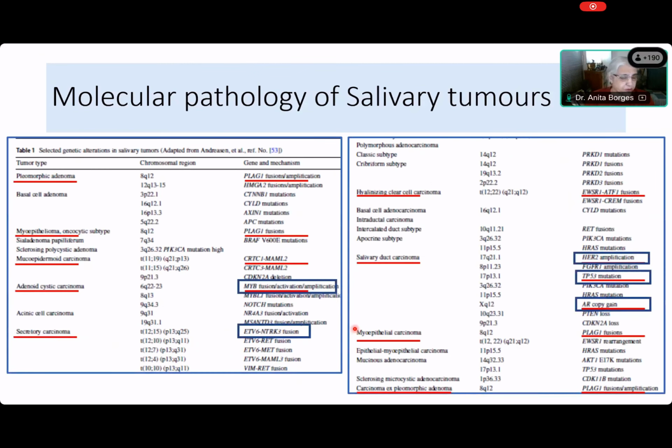Hardly anybody does molecular pathology on salivary gland tumors, but it has become important for us because when you have a translocation, a fusion, you may get abnormal expression of a particular gene. And we use that. We use MYB, for instance. In adenoid cystic carcinomas, there are MYB fusions or amplifications, and we now have an antibody to this MYB protein, and we can see it in adenoid cystic carcinomas.